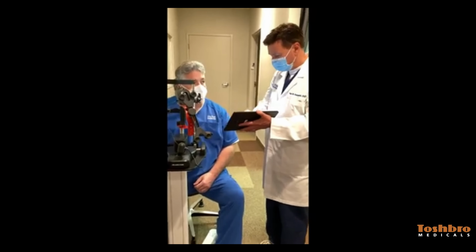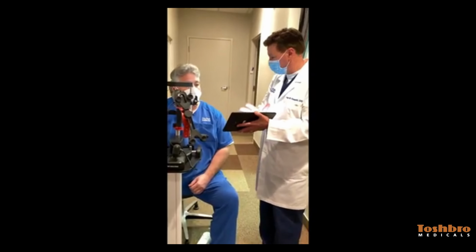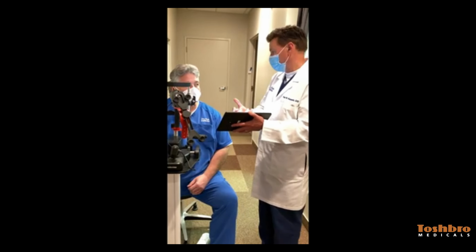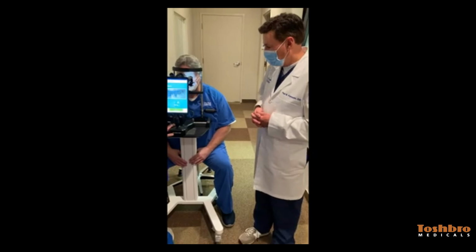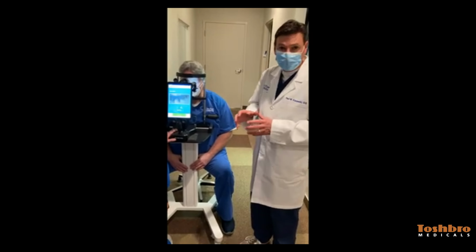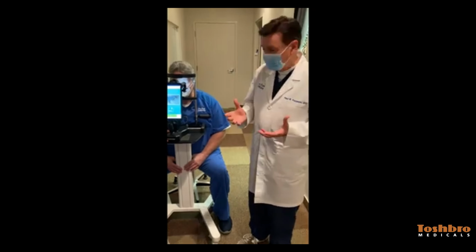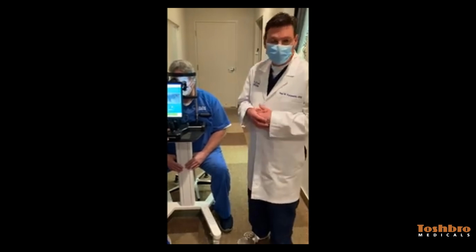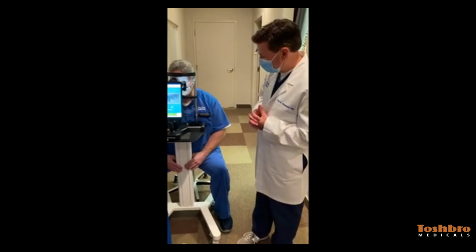And keep in mind that even though you have an entire array of meibomian glands, and it's so important to know what they look like, their function is also key. Right now I want to take you through another feature in this technology of MeCheck, which is the ability to image up to 1,000 times, not that you'd ever go to that level of magnification, but you could if you're really trying to isolate a lash or two or show perhaps Demodex collarettes that are present in blepharitis.